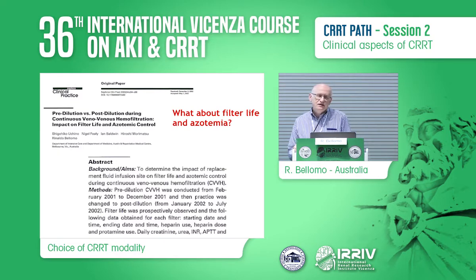If you did that, then the downtime, the time that you have when there is no filter on, might also decrease. So even though you've lost efficiency when you're doing the treatment, because the filters clot less, the overall delivery of therapy might actually be the same. And it might not be different, but it would cost you less because fewer filters would clot.